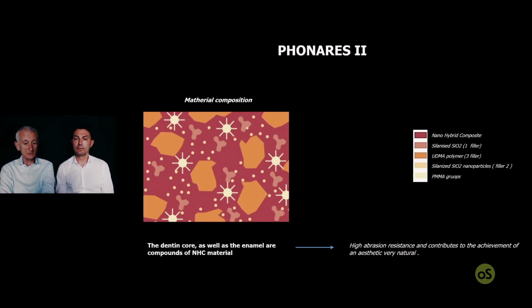our students will want to know when you select a Brident or a Candulor or a Creopal, whatever. So I understand there are different kinds, and all of them are excellent teeth. Is there any particular reason why you select? Yes. Sometimes one tooth and another time another one.